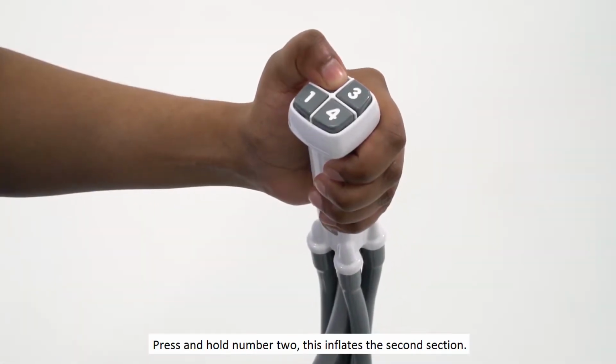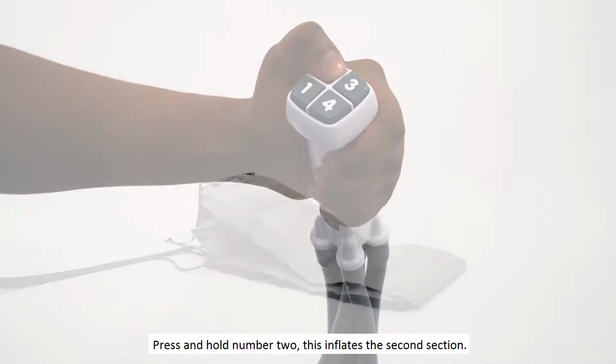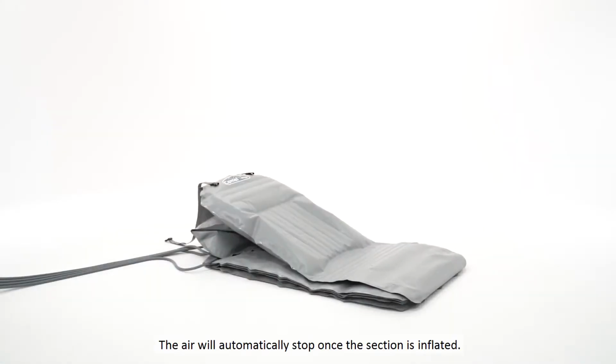Press and hold number 2. This inflates the second section. The air will automatically stop once the section is inflated.